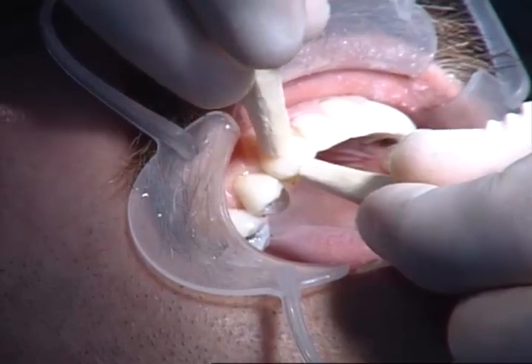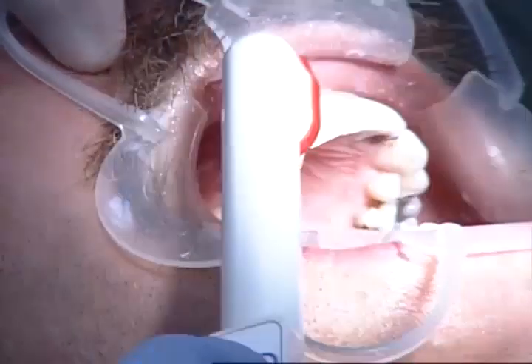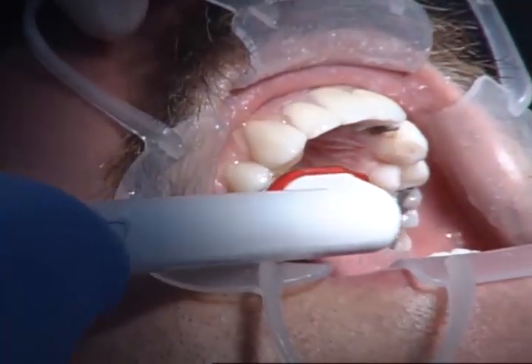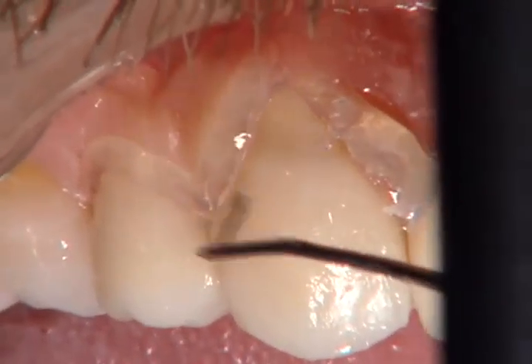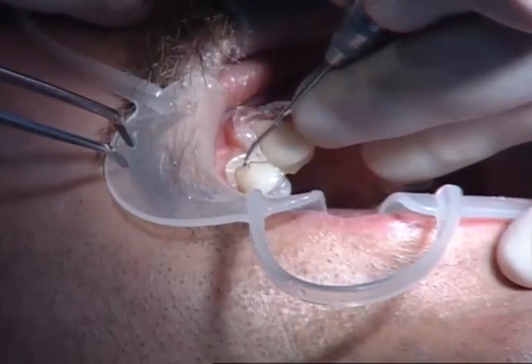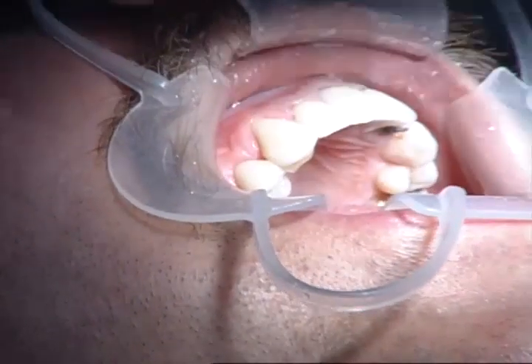And I get a lot of questions from dentists about, you know, if these no prep veneers are only 0.3 of a millimeter thick, aren't you afraid of breaking them? And it seems like in the old days when we were using feldspathic porcelain, that was a concern. But today with the pressed ceramic, the thin press, pressed to 0.3 millimeters, and you can see how nice that cement comes off in one piece. That, again, is the Variolink veneer from Ivoclar Vivadent.